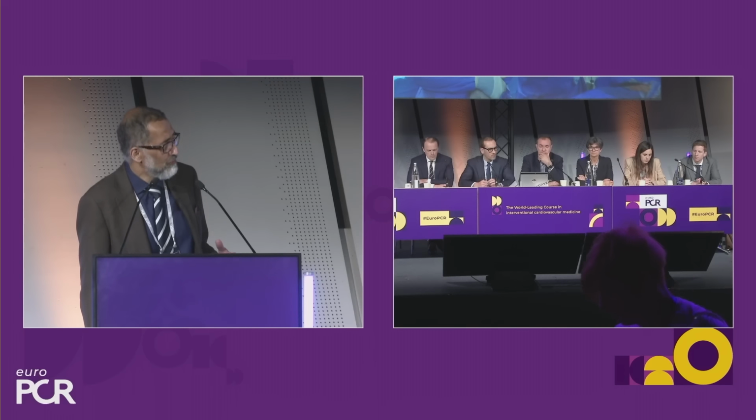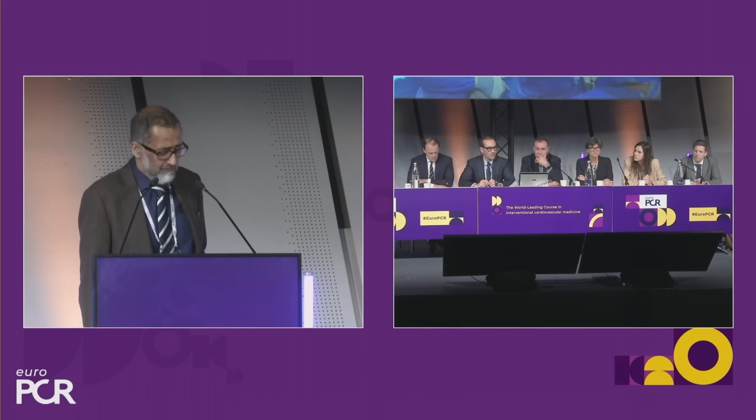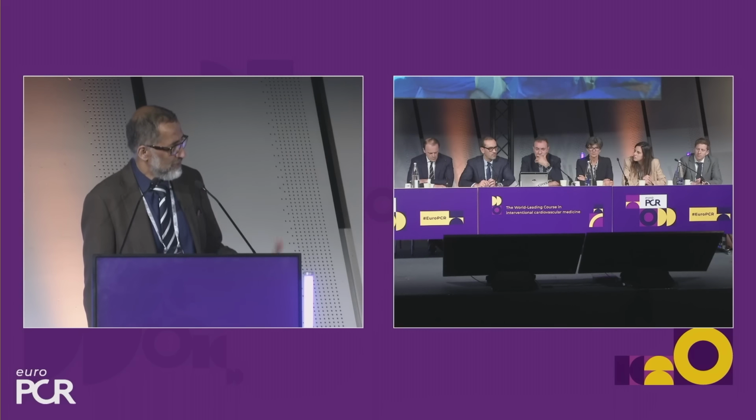So there isn't a significant amount of AR, both on the echo and on the hemodynamics. I think the valve looks, it's an oval annulus, so it will look oval, but I'm not thinking this is very underexpanded. And a self-expanded frame will expand a little bit more in any case. So I don't want to put a pacemaker in, and therefore I don't think there's a need for a post-dilatation here.